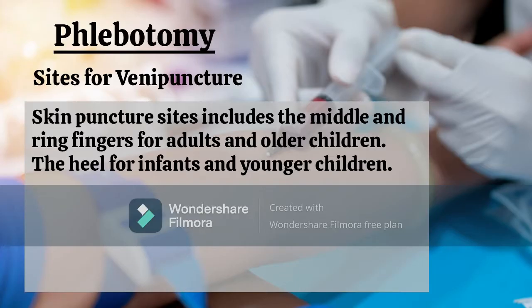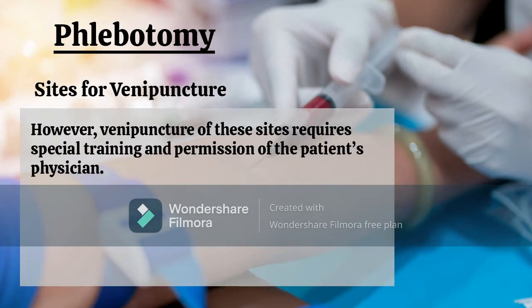Skin puncture sites include the middle and ring fingers for adults and older children, and the heel for infants and younger children. However, venipuncture of these sites requires special training and permission of the patient's physician.